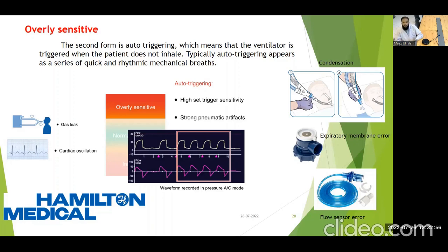After 7 days, we discard the breathing circuit. The HMEF filter, breathing filter or bacterial filter has a lifetime of 24 hours, so after 24 hours we discard it. And after 28 days we discard the flow sensor; this is the guideline of Hamilton Medical.